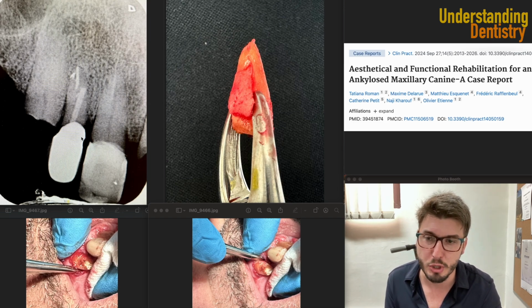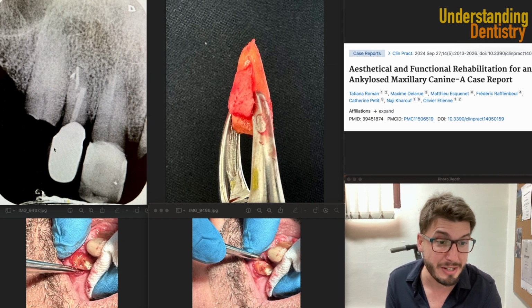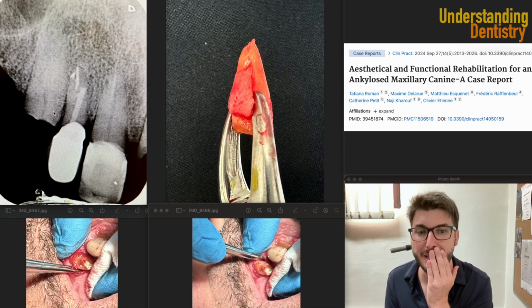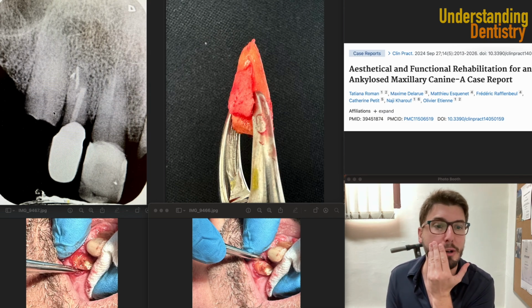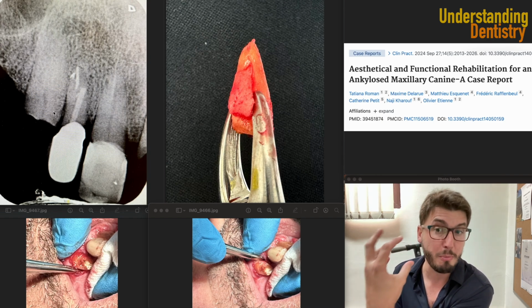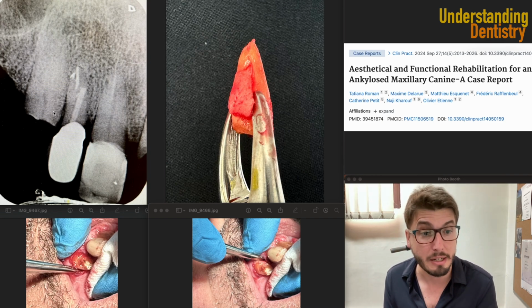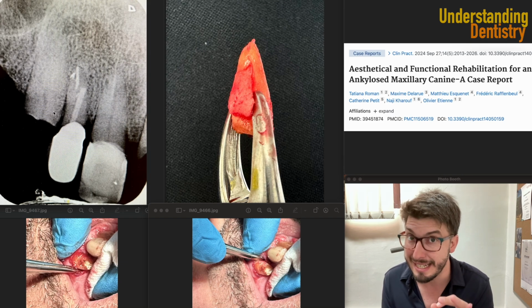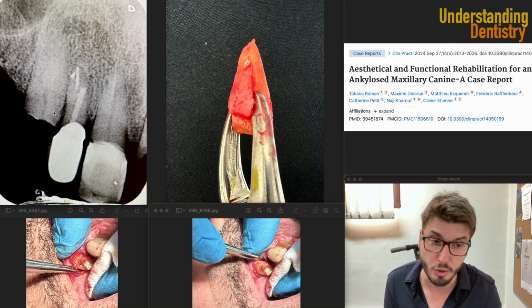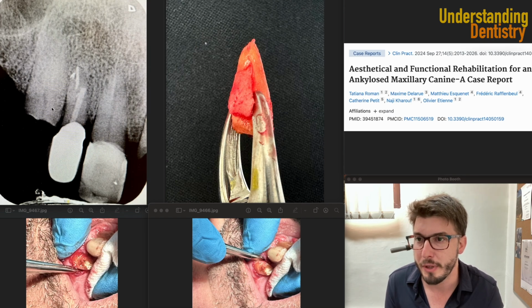This interproximal space between the lateral and the central incisor is actually better depicted than this interproximal space, okay? So basically the film should be a little bit more to the distal, okay? And then the X-ray source as well, completely parallel to the interproximal spaces, all right? So that's basically what should happen here, and it's not the best radiograph as a result, okay?